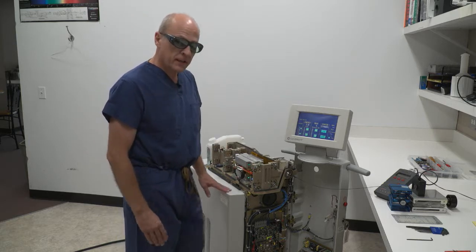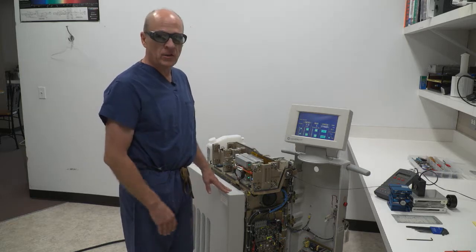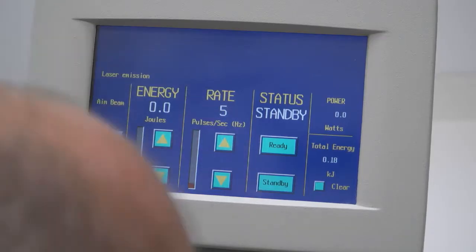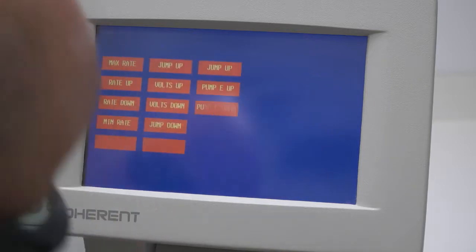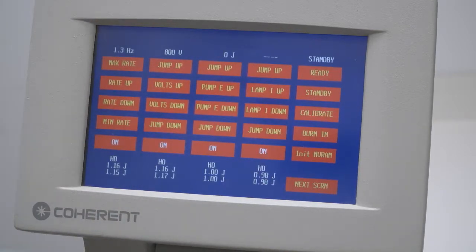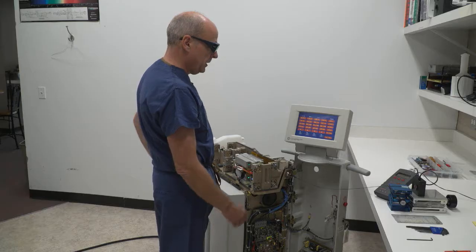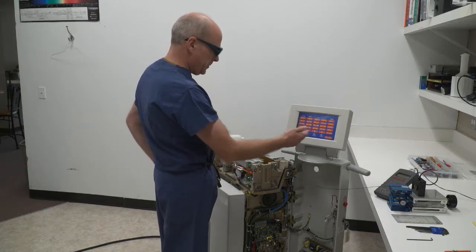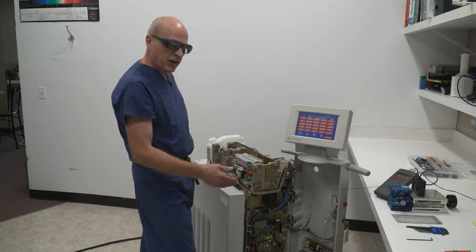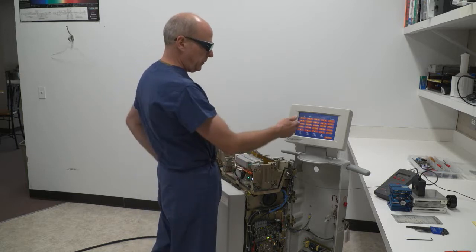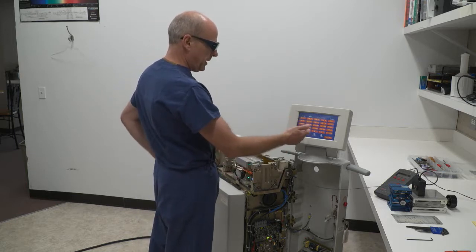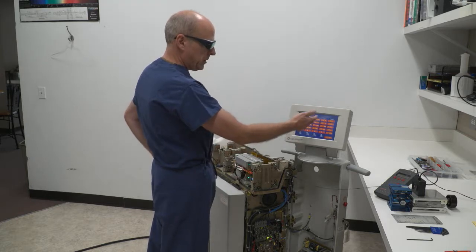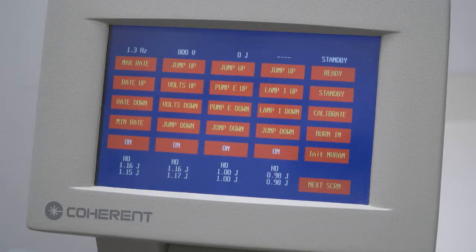But what I'd like to do instead is go into the service mode and take a look at some of the parameters of the laser. I have various screens that tell me a lot of information about how the laser is running. The first screen allows me to turn any given brick on and off to work on it and tells me the condition of the brick if I put a certain amount of energy or rep rate into that brick.